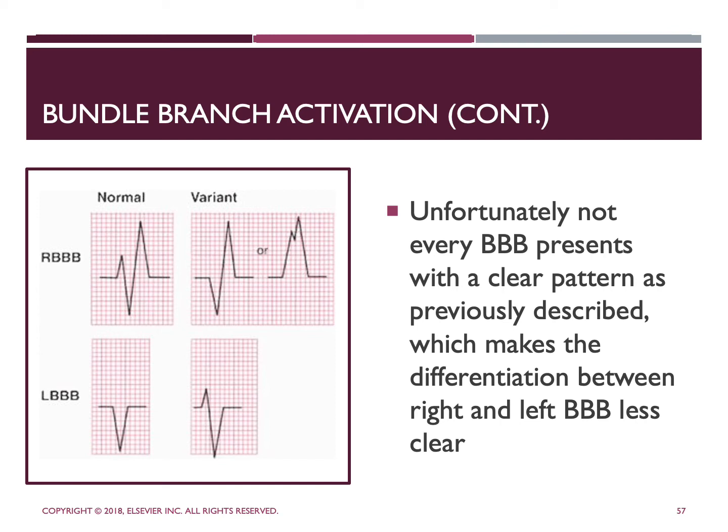So you'll see the top one here, the normal right bundle branch block, and then a variant of it, and then on the bottom here we have that left bundle branch block, okay, and then a variant to the right of that as well.